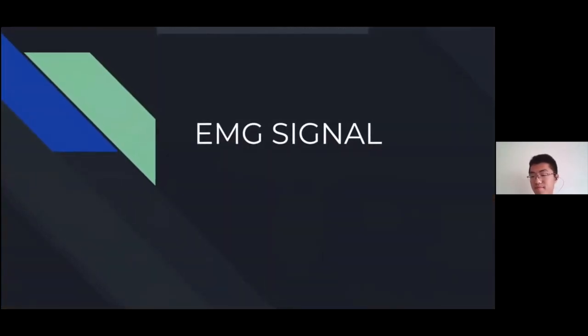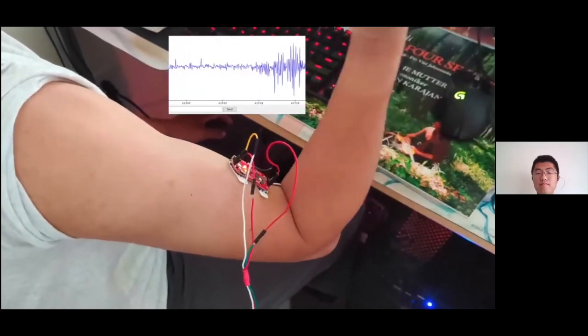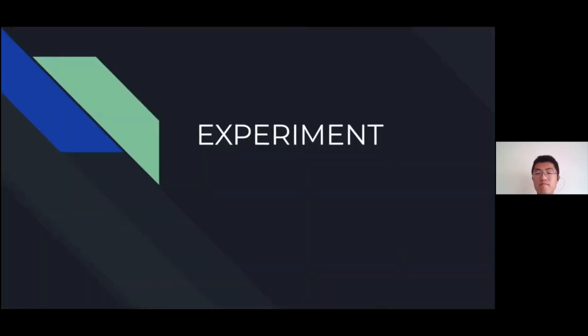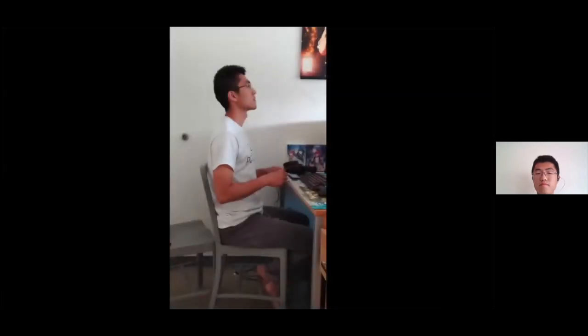Hi guys, we are the True Posture team. I'm Jiyu Zhou. I'm Dom Jiang. First, we want to show you how EMG signal respond to intense muscle movements. For example, now we are exercising bicep, and you can see the EMG signal. In this project, we focus on the lower back muscles. And right now we are seeing the sitting straight posture. This is the hunched posture.